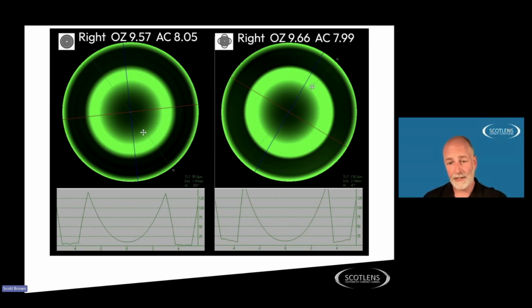Now we don't like composite maps because what tends to happen is you're going to make a composite of joining up 3 or 4 different maps. You might have 2 of those maps that are perfect and 1 or 2 that are not quite perfect. And when you composite them, you actually make a less perfect map than you had from 1 or 2 of your originals. So the central fixation one is easier to do with the patient, it takes less time. You get enough information from the point of view of designing any corneal lens, and it's also more accurate.